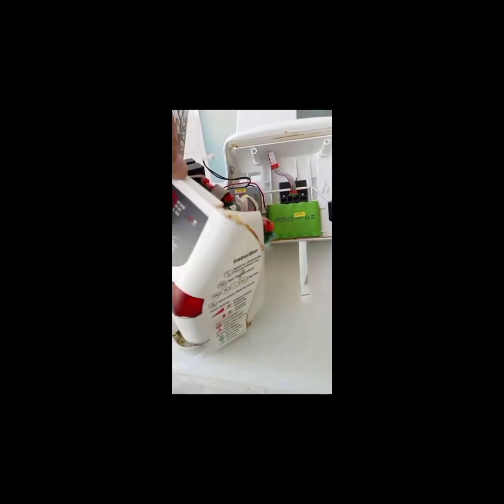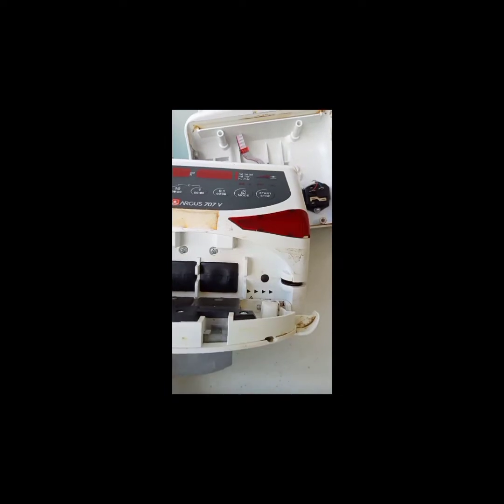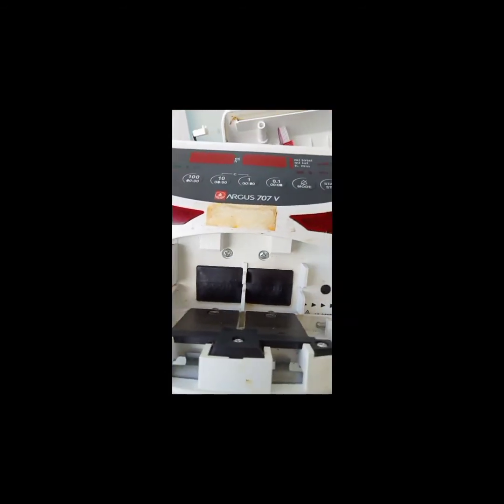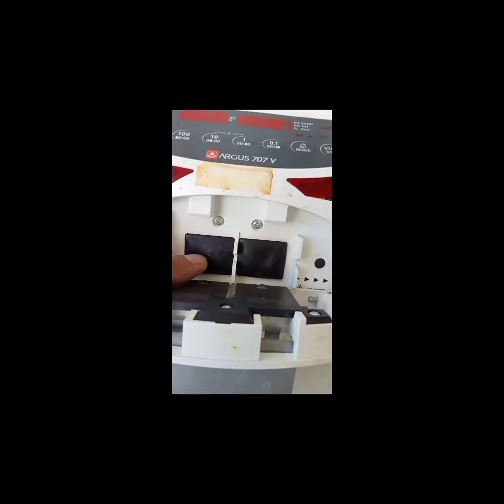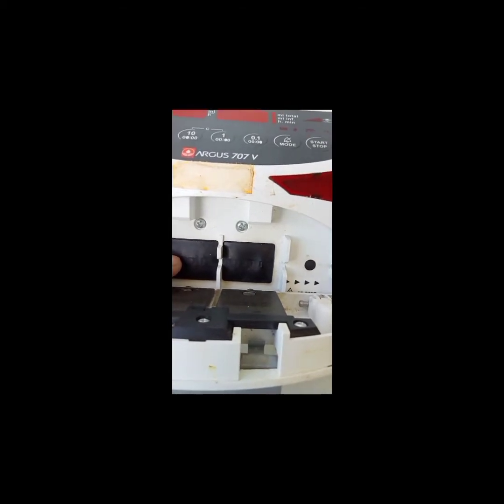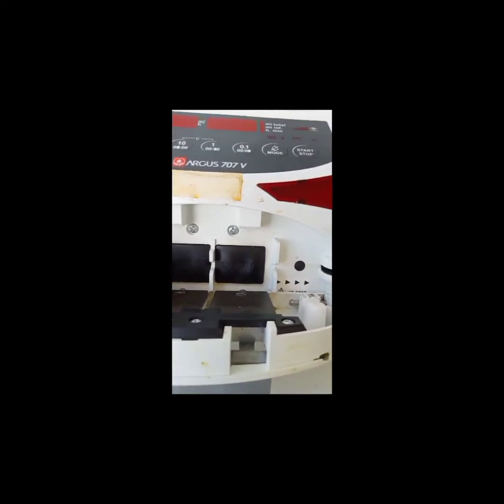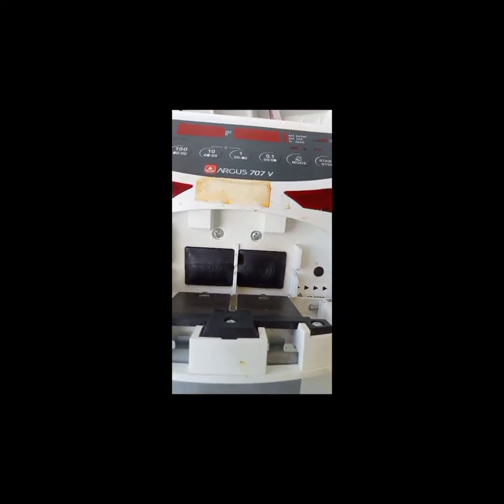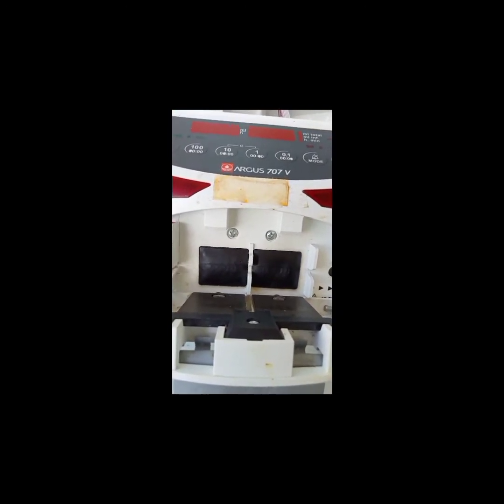And when you try to see the front, okay, we have here the sensors, these two. Actually, this one right here is the ultrasonic sensor. This is where the bubbles are detected from the tubings. And we have the peristaltic sheets. It is the same as my first vlog, the SK600 series infusion pump. The same operation. They used peristaltic sheets in order to push the fluids from the tubings going to the patient.